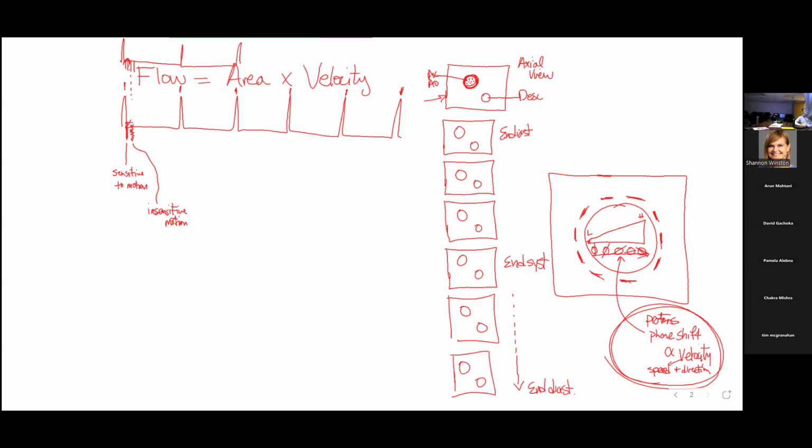And so one key thing to recognize is that TR, which was this time between these two, see how they're really short? When we're doing the flow, the TR is twice as long. Okay, because we need two phase encodes to make each line of our phase map.